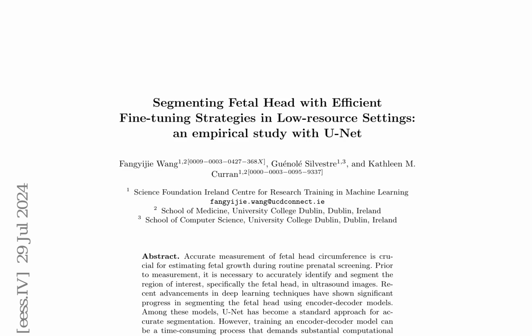Segmenting fetal head with efficient fine-tuning strategies in low-resource settings, an empirical study with UNET. This research focuses on accurate measurement of fetal head circumference for prenatal screening. It employs deep learning techniques, particularly the UNET model, for segmenting the fetal head in ultrasound images.